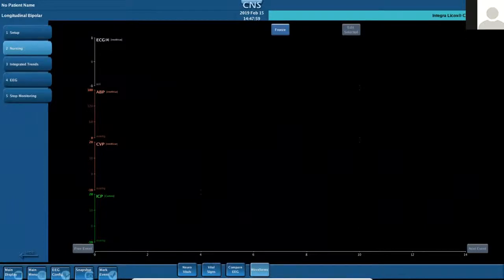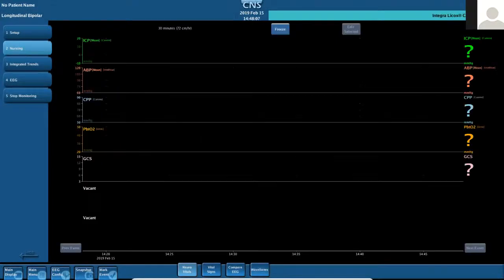Thanks, Kat. That's great, because that's a good tool. If you're ever lost and you don't know where you are, just go back to your main display. We typically default that to the neurovital signs screen. That's something that we automatically do, but that doesn't necessarily mean that's what you want for your institution. It just depends on who the main user is of the device, because if it's neurology, it is the EEG screen. If it's more bedside nursing, then we want to have it on the overview pages usually.